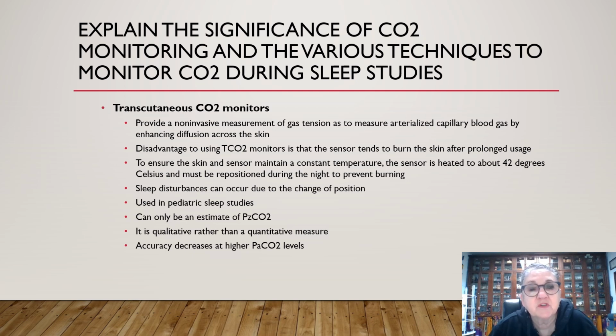and must be repositioned during the night to prevent burning, and this can cause sleep disturbances when we change the position. It's used in pediatric sleep studies and can only be an estimate of PCO2. It is a qualitative rather than a quantitative measure, and accuracy decreases at higher PCO2 levels.